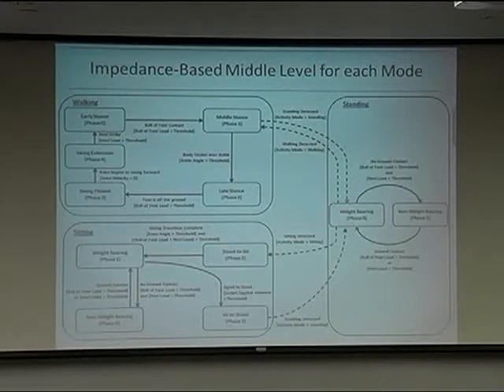So battery technology is part of the different types of technologies that have gotten much better to enable this. Battery is a big one. Rare earth magnet brushless motors is another big one. The microelectronics is another big one. The computer that we use, I call it a computer, it's the size of a stamp, and it consumes 400 milliwatts. That doesn't mean a lot to that many people, but it has the same computational capability of a chip that 15 years ago would have consumed 100 times that much power. And that in and of itself would be enough to make this not doable.